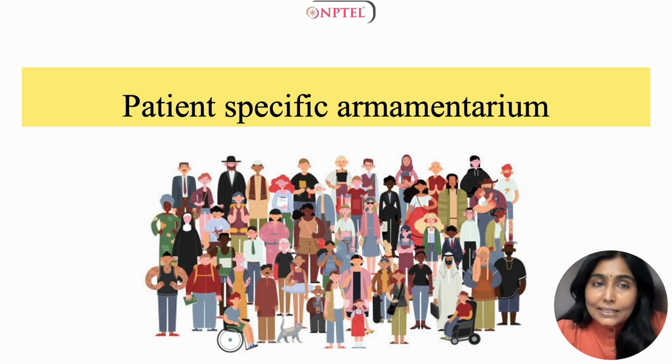When administering dental anesthesia, it is important to remember that not all patients are the same. It is essential to tailor the armamentarium and the technique to each individual patient. This personalized approach ensures effectiveness, minimizes complications, and addresses unique patient needs. Several factors must be considered when selecting the appropriate armamentarium for a given patient, including their medical history, anxiety levels, age, and the complexity of the procedure. So let's try to focus on the patient-specific considerations for the dental anesthesia armamentarium.